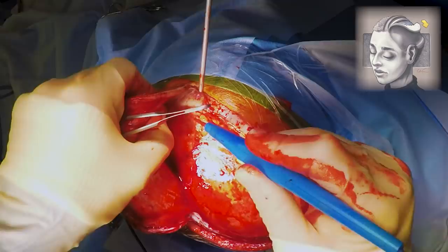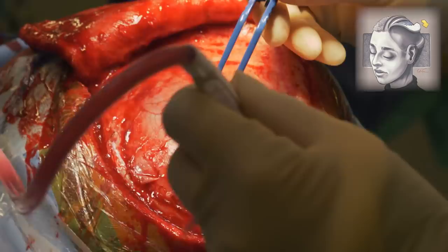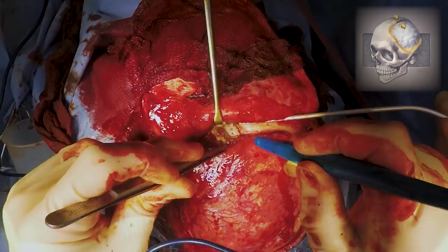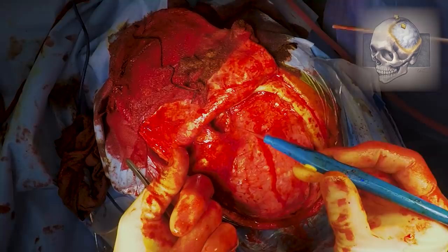Now you can see that we have the brain and a covering of material over it, which will probably be the dura and some other material that we would have placed during the original operation. Now we need to start teasing away the scar tissue away from the bone edges, otherwise we can't get the screws and the cranioplasty plate to sit nice and flush against the skull. Working methodically and carefully to tease away all of this scar tissue. At this point Mr Uff's left finger is underneath the temporalis muscle which has fused to this covering of the brain.